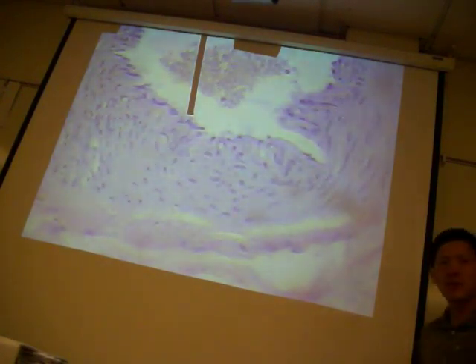That portion also is referred to as the inner elastic membrane. Right? So for those of you guys that have already had anatomy, this should be very familiar to you guys. So the reason why I showed you this artery right off the bat is because I wanted to show you guys specifically where that simple squamous is.